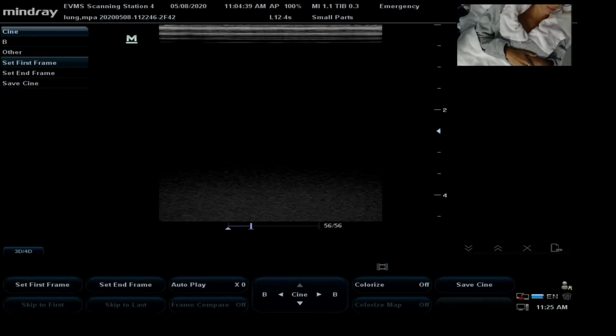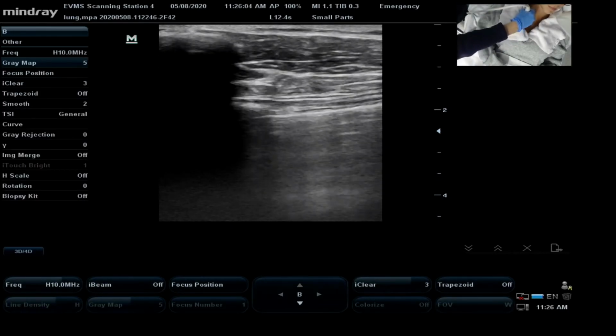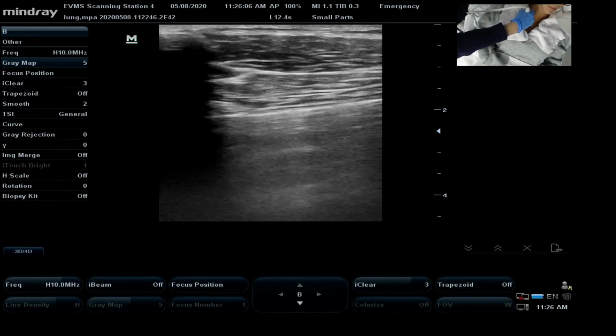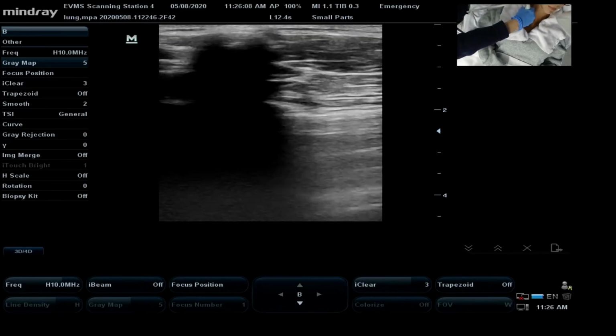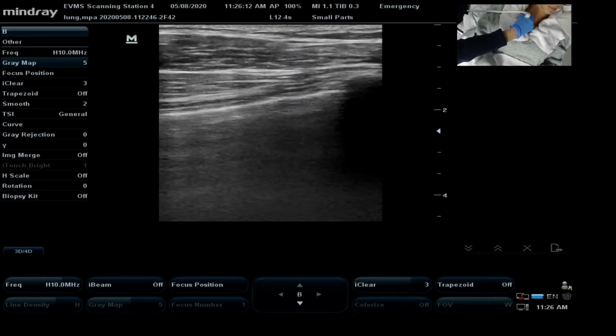So what you're going to do, I tend to go ahead and palpate the clavicle, because I know that just inferior to that is going to be that first lung space that I want to see. And I'm going to place my probe on that lung space, and I'm going to unfreeze my machine. Here we have that intercostal space. I'm right over the clavicle. I'm going to drop down and try to bring the other rib in.